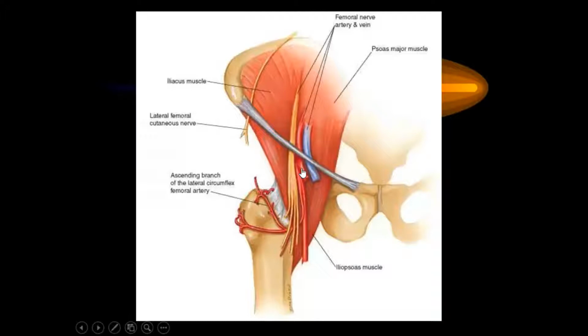So there's a bony structure underlying the vessel upon which you can compress the vessel by manual pressure if need be. Whereas if you go too high here, the vessel dips into the pelvic floor, so it becomes uncompressible. And if there's a bleed, you'll end up with a retroperitoneal bleed. So that's something to avoid, high punctures.